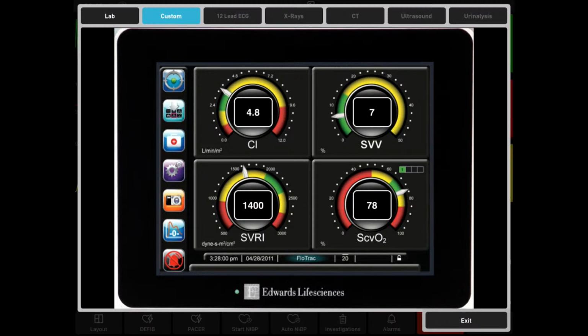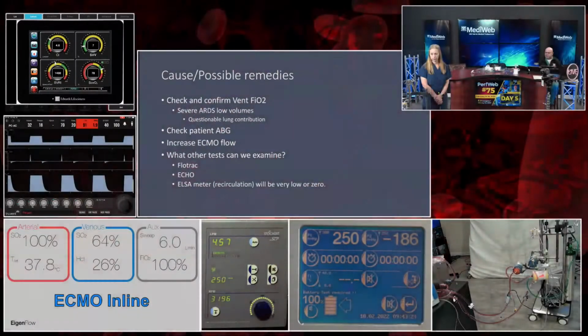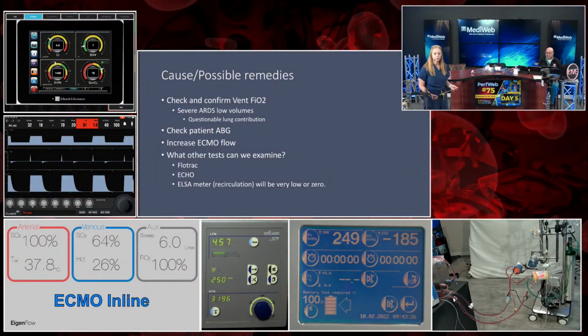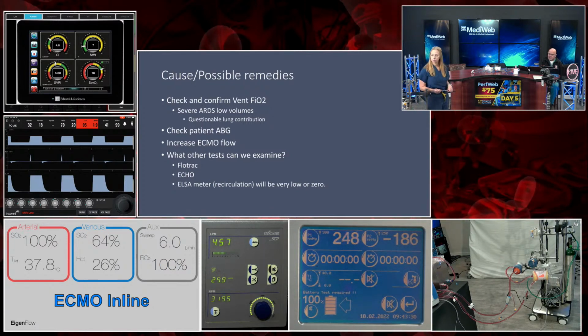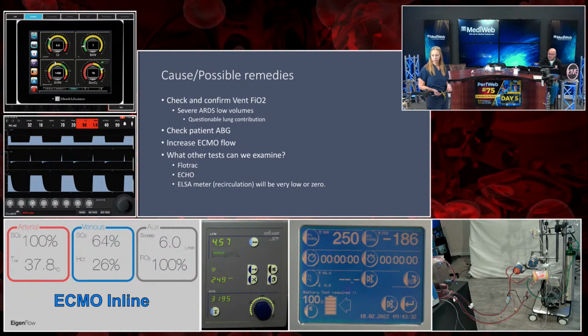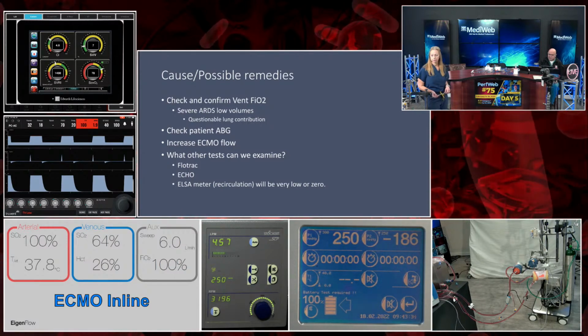It's simply bypassing the ECMO, going into the RV and out. So what is in the pulmonary artery going to the pulmonary veins, getting back into the left side of the heart, is a mixture of all of that. Okay, so go ahead and take that down. So what's the next thing we can look at? Well, we can look at an echo. So let's do that. Let's go to an echo. And let's see what this patient's ventricle looks like.